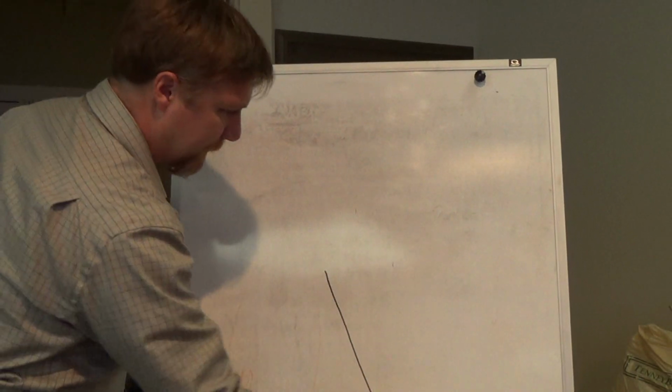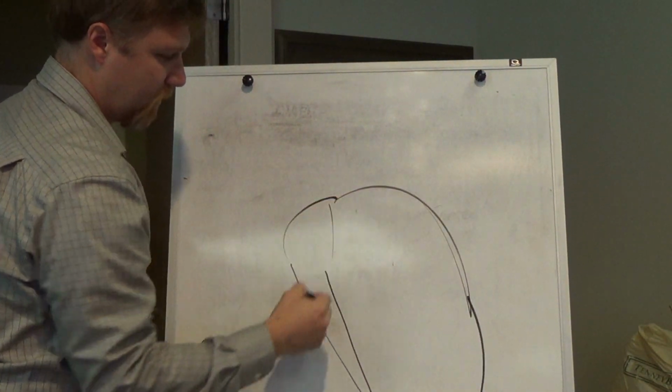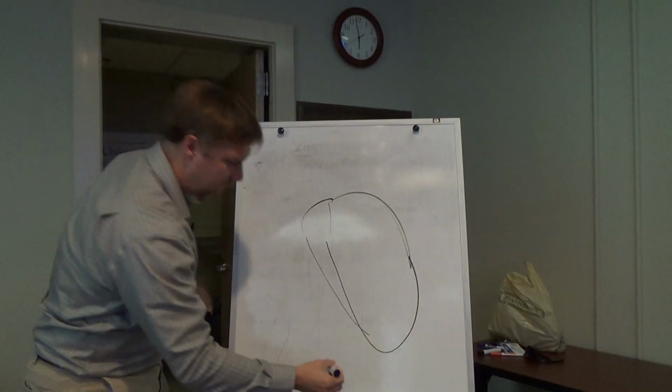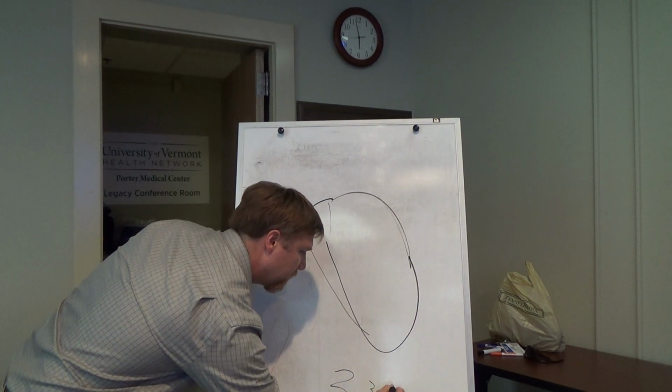So when you look at the heart, Do you work in this office? No, I'm an ambulatory nurse educator. For Chelsea. so when you've got the You print his slideshow. inferior leads, Before his slideshow. 2, 3, and F, I'll show you.